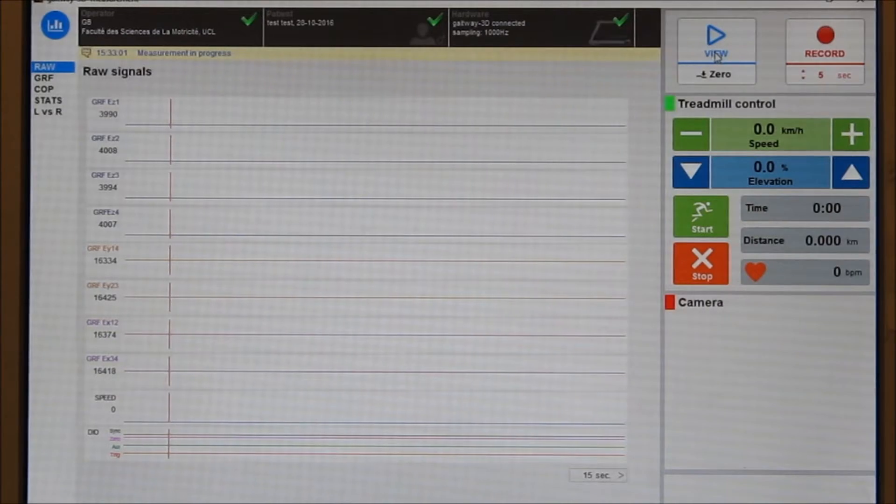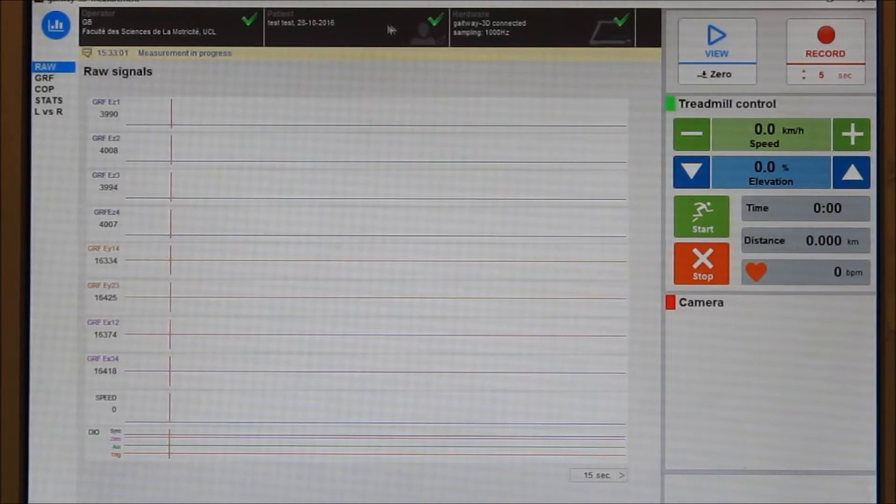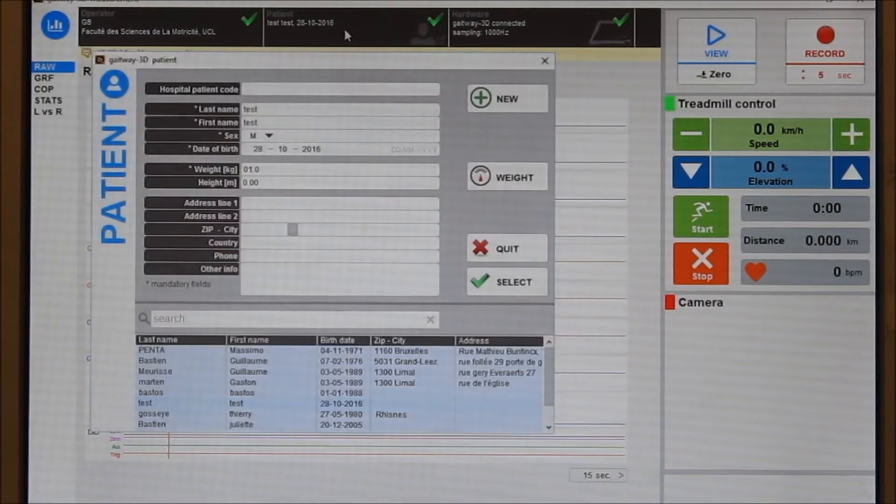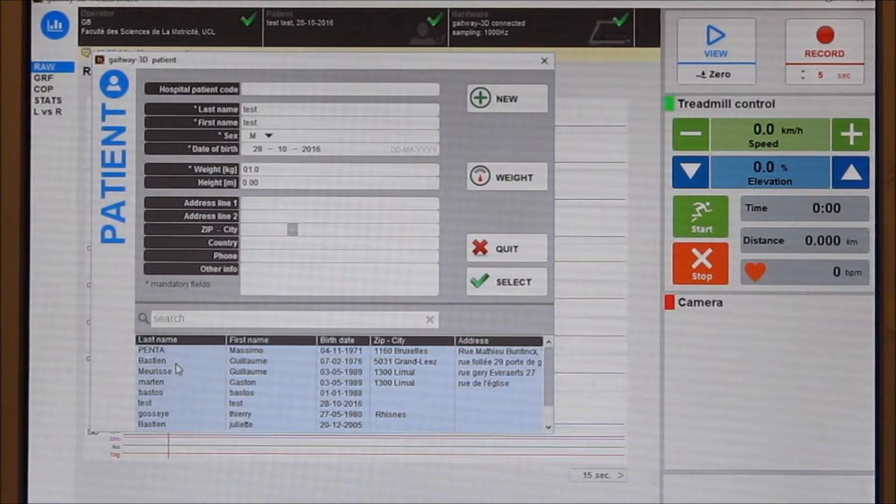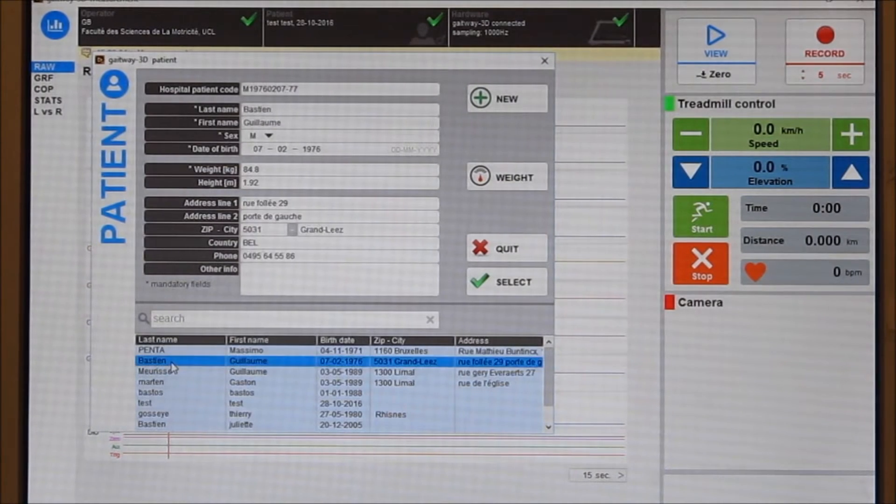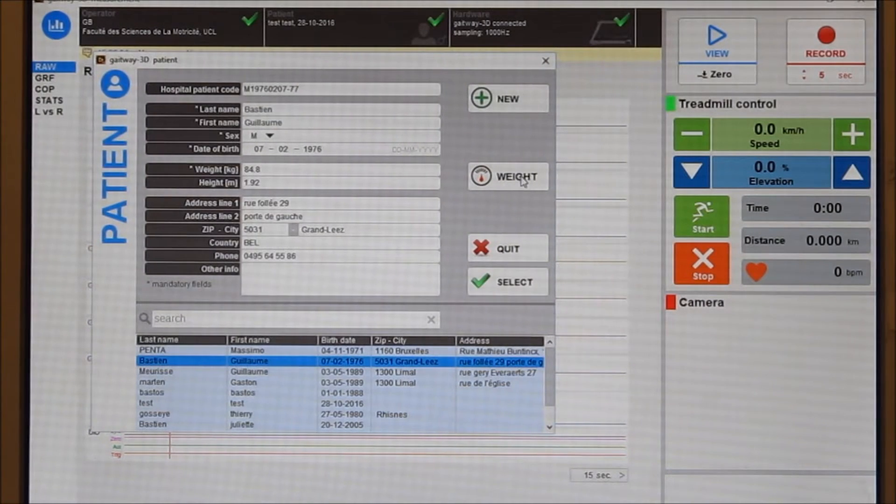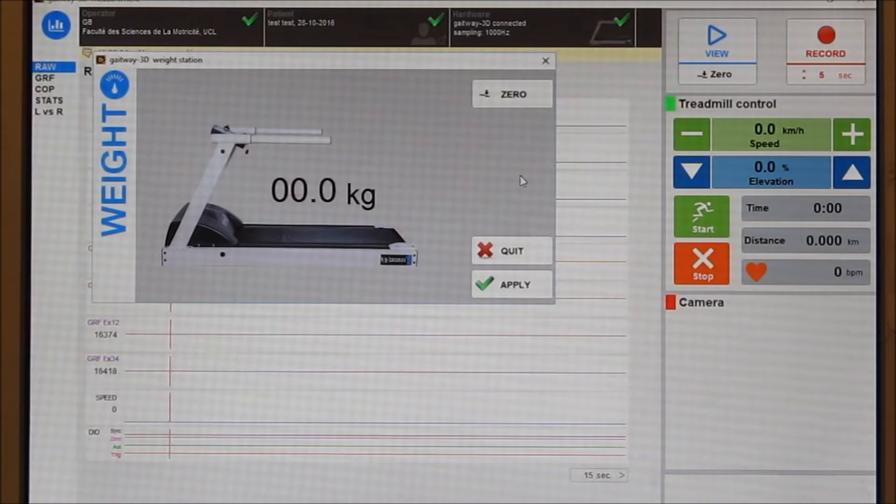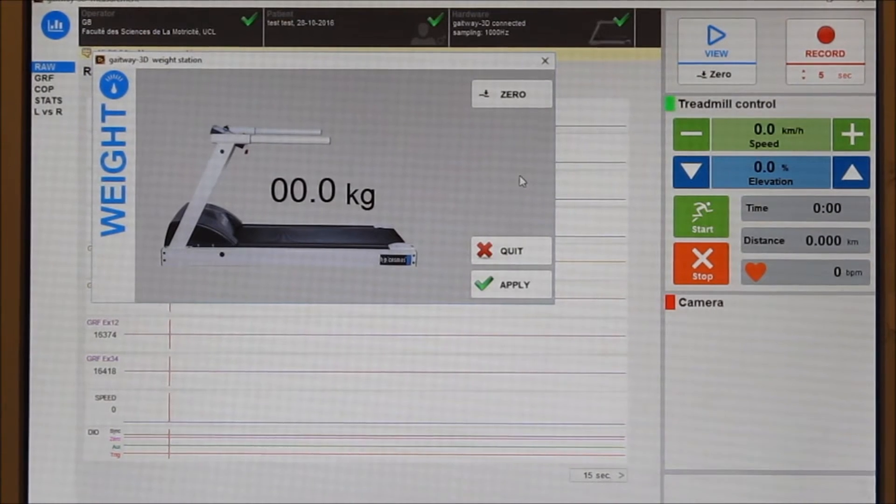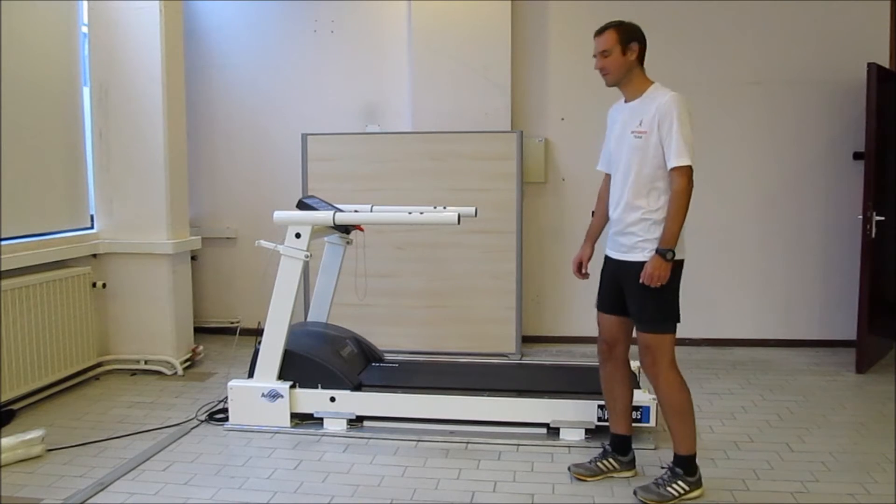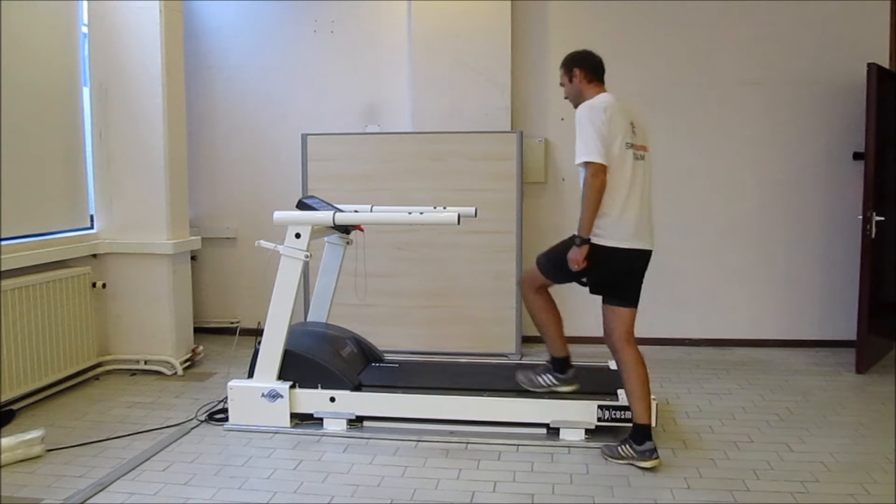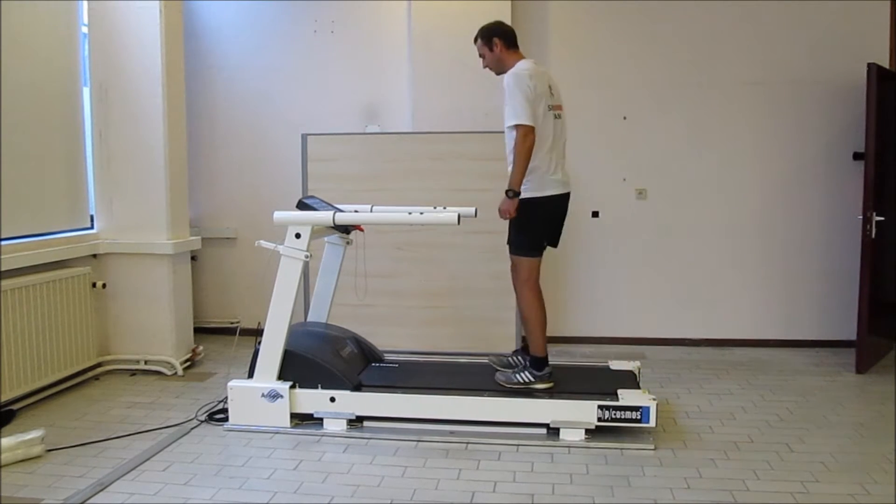Before recording data, we click in the patient box and select the patient record in the database. Then we check the patient body weight using the Gateway system by entering the weighing scale mode. The subject is standing next to the treadmill.